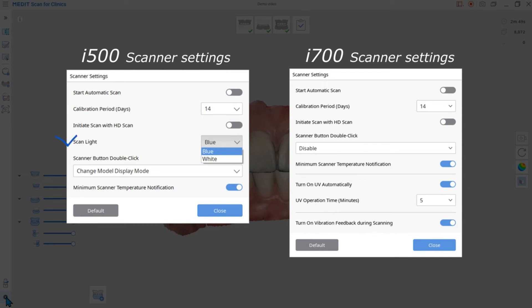The first feature is Scan Light. The I500 has two scan light options, blue and white. The blue light is for most cases, whereas the white light can be applied to patients with blood and saliva.